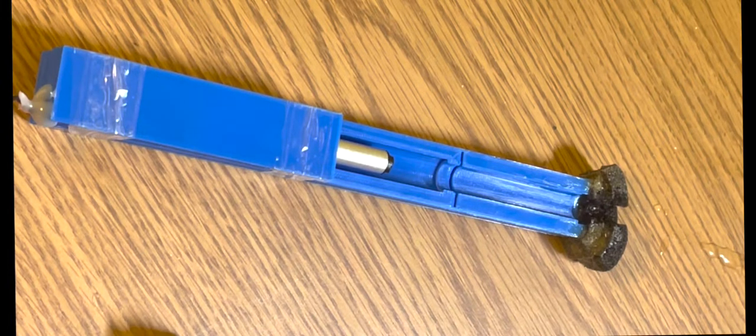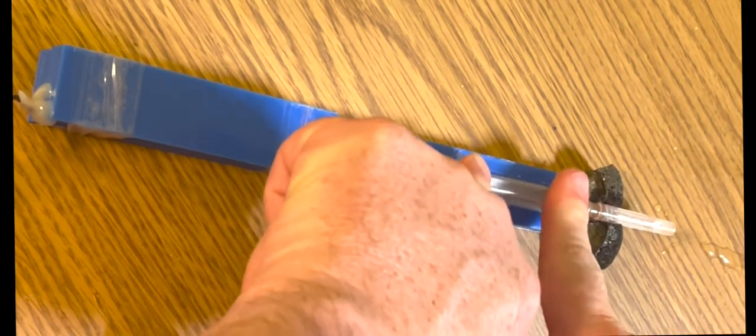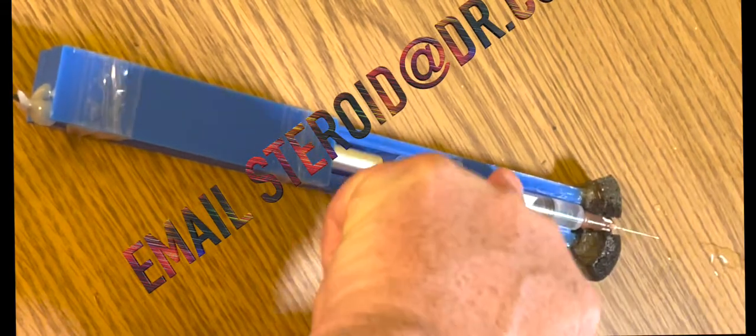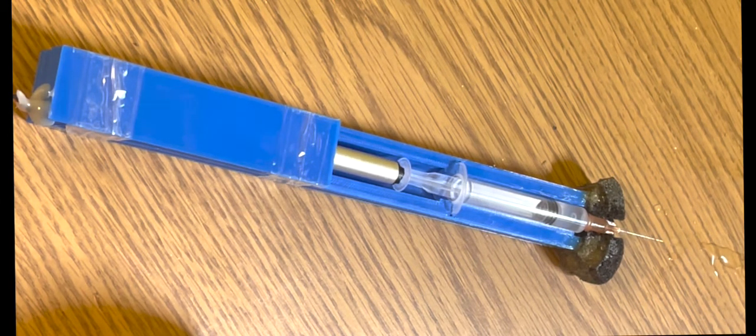With this device, all you do is put the syringe in — it snaps right in. Take the cap off and you'll see the plunger start moving towards the needle. This is also the controlled pace mechanism.